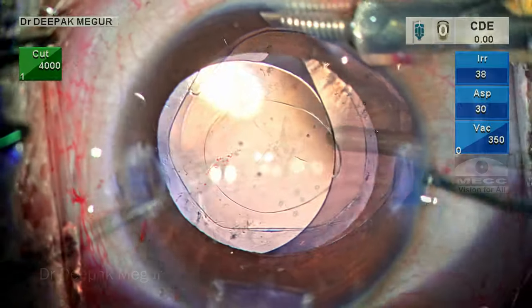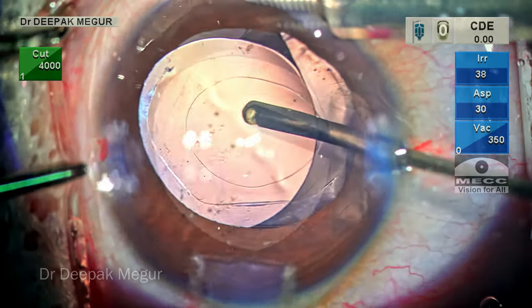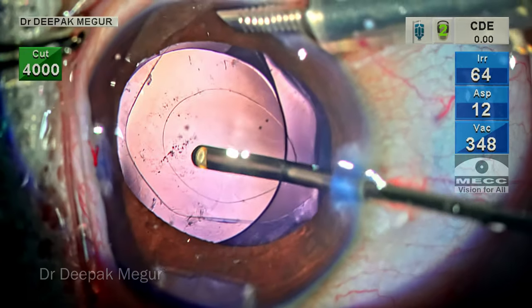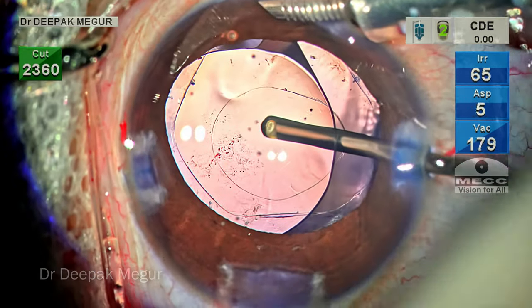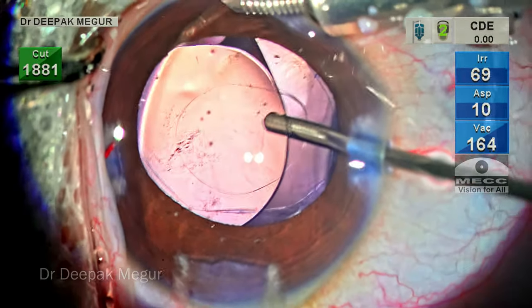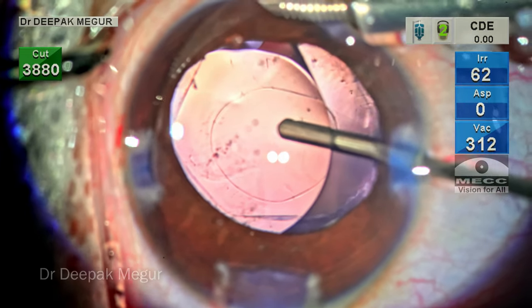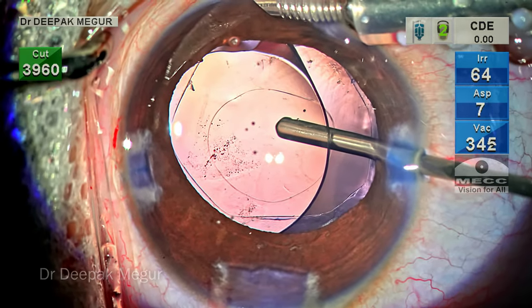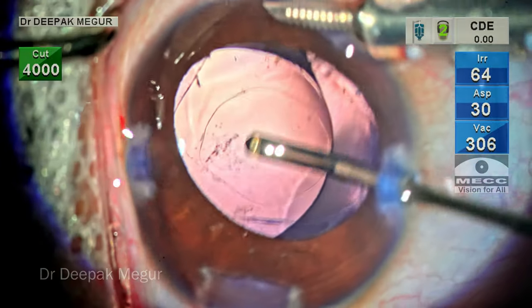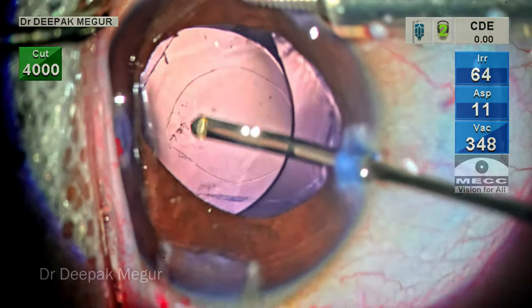Time to perform the anterior vitrectomy. The vitrector is introduced under the intraocular lens. The infusion is provided by the AC maintainer with the bottle height kept around 50 cm. The cut rate I'm using is the highest possible on this machine. Doing anterior vitrectomy is relatively easy — just hold the instrument behind the level of the posterior capsule and press the foot pedal. There's no defined endpoint in these cases as we are doing a primary vitrectomy, not due to a PC tear. But this has to be a limited anterior vitrectomy — just enough to prevent the anterior hyaloid and anterior vitreous from acting as a scaffold for PCO formation.